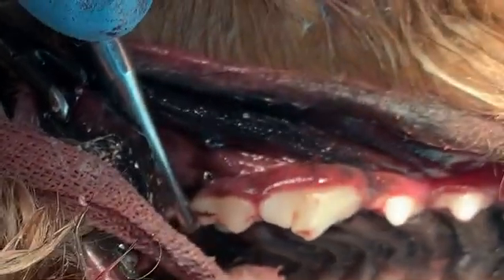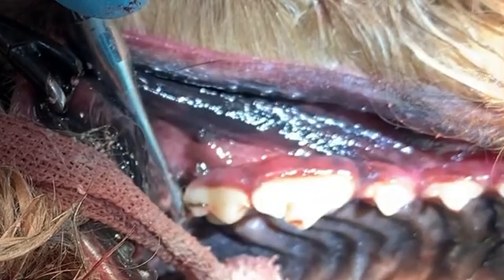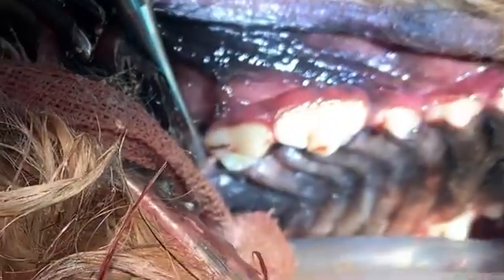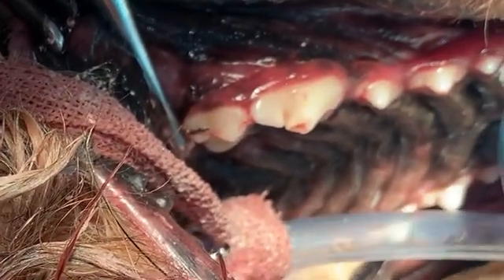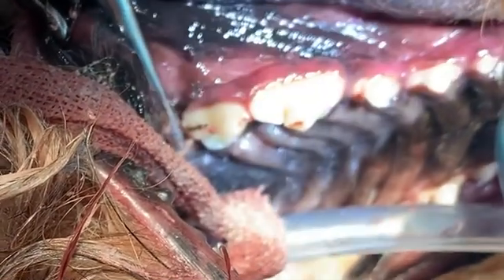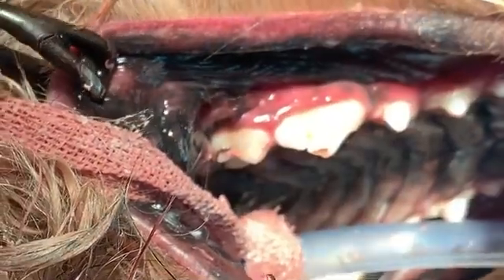We're going to kind of wedge it in between those two teeth. Once we have it in there, we're going to twist and just apply some steady pressure. Apparently the patient is getting a little bit light, so we'll give him a break here.